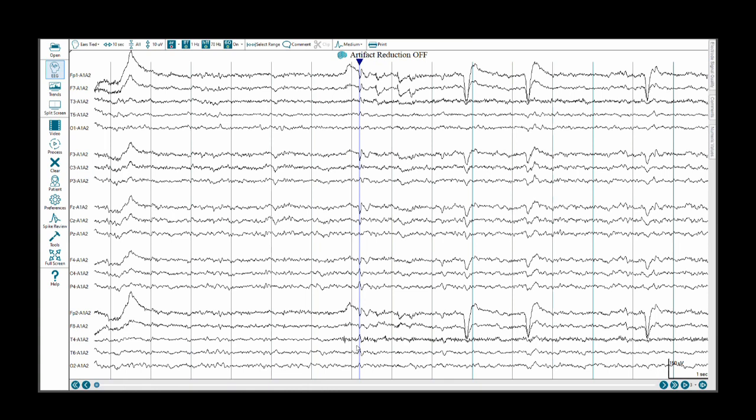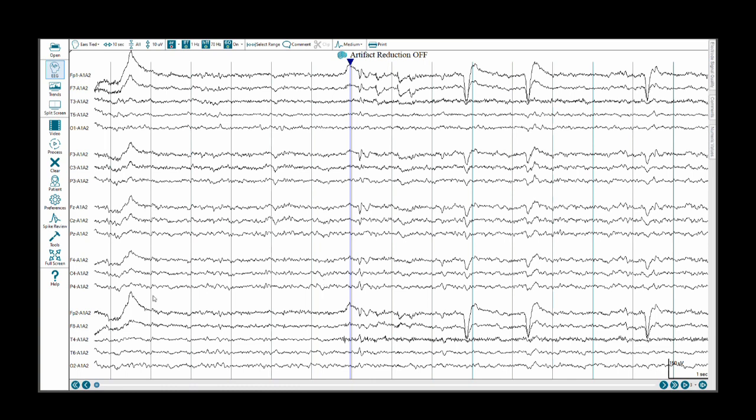We can see that there is a negative discharge at T4 during this moment. T6, somewhat of a discharge at O2, but not as high amplitude. I'm just going to scoot over the sweep edge so we can see this waveform better. Also a field to P4, which is strong, so C4 is involved as well. Therefore, it looks like C4, P4, T4, and T6 are the complicit electrodes in this discharge.